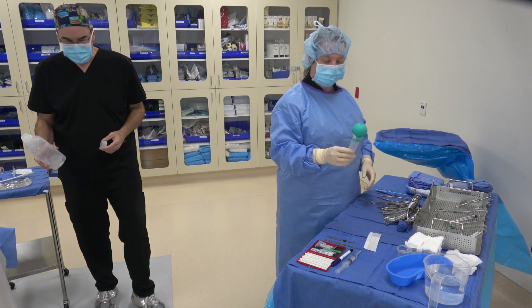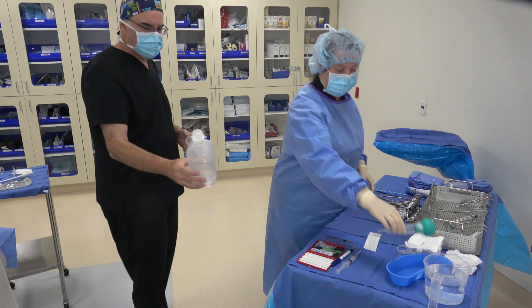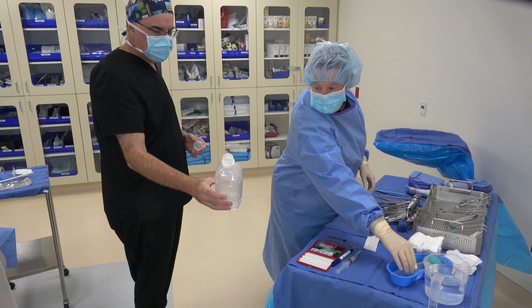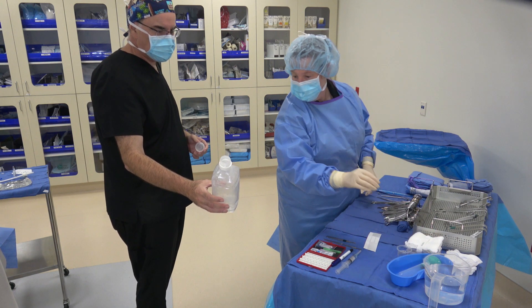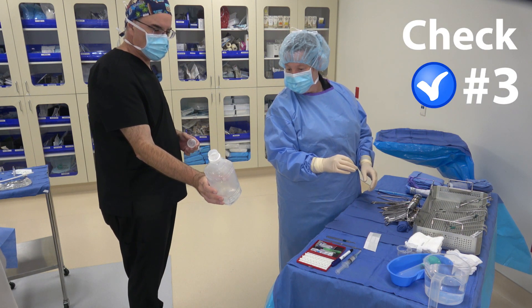Once the irrigation is labeled, it's time for the third check. The circulator will again hold up the irrigation container and you will both look at the label while one of you reads it out loud: '0.9% sodium chloride, March 2025.'